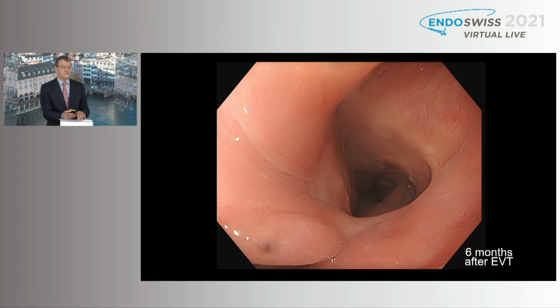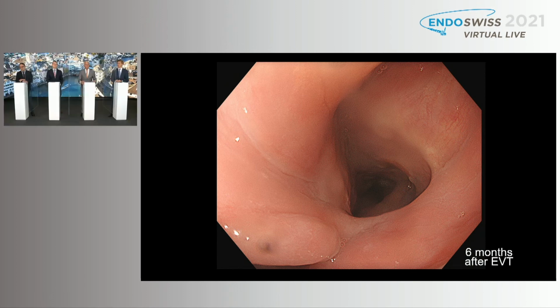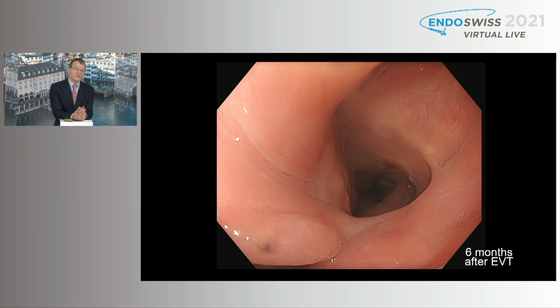Thank you, Stefan. That's an impressive case. Did you, after 6 sponge exchanges, at some point close the defect yourself with clips, or did you have this closed spontaneously? No, I think after this time it makes no sense to use clips to close the defect.